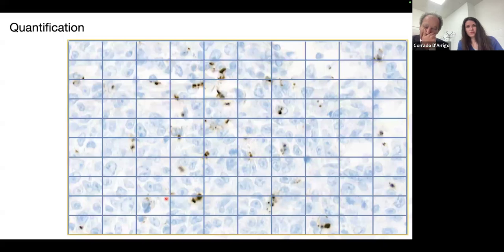So, techniques for that. One is, in your head, or practically, if you take a photo, divide the area into 100 separate squares, because if I can fill up one square with the area occupied by the immune cells, that's 1%. And we can see, if we have a little bit of time, how we can do it on core biopsies. We need to have an understanding of how big the area of tumor tissue is and how big 1% is. And then perhaps in our head, we can fill it up or not fill it up with enough cells.